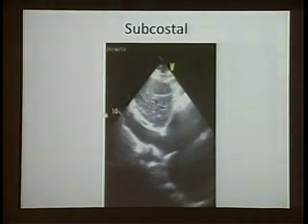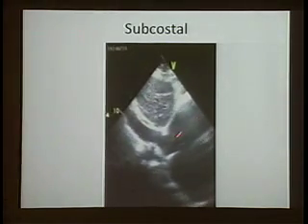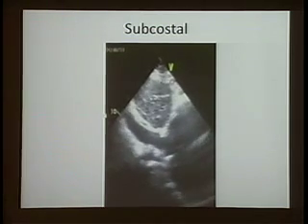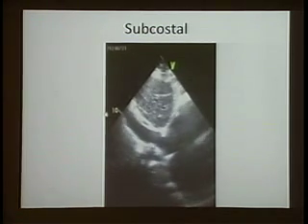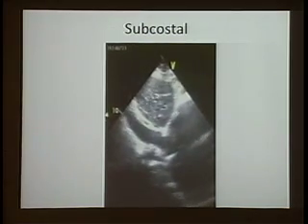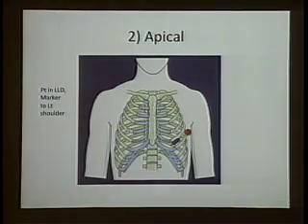And this is how it looks. See the liver, IVC, and you see this is the right atrium. And again, you're going to try to use not just the diameter of the vessel, but also the pattern, the changes in diameter of this vessel when you're breathing. And we'll talk about that in the next lecture.